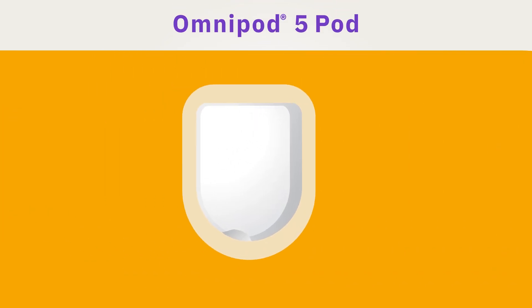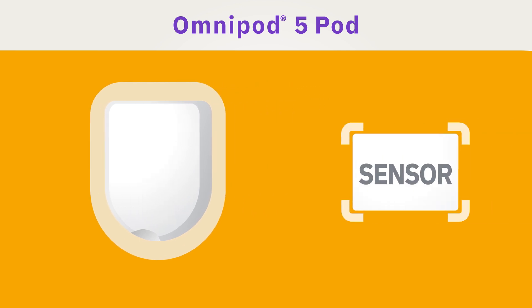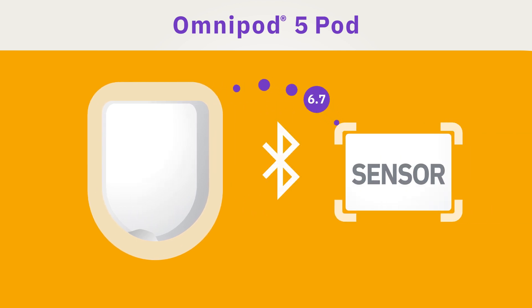If you have experience with the Omnipod system, the Omnipod 5 pods look and feel like the pods you know. The difference is that the Omnipod 5 pods are equipped with Smart Adjust technology. They can receive sensor glucose values and use these values to automate insulin delivery.